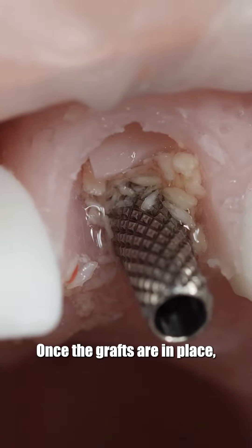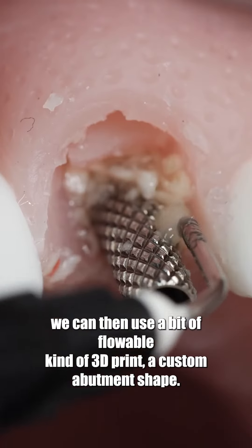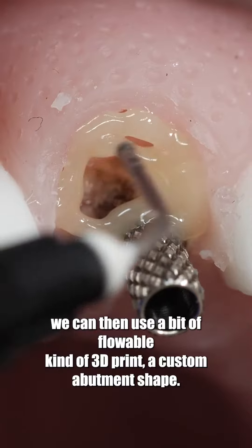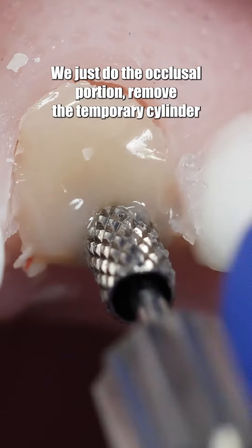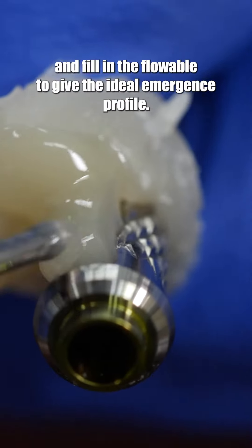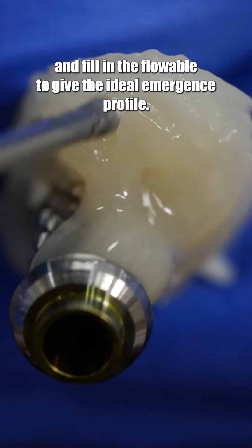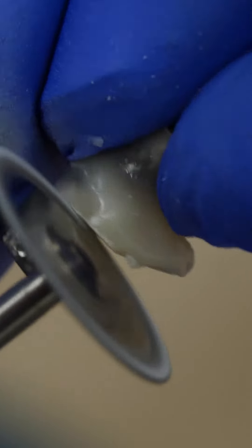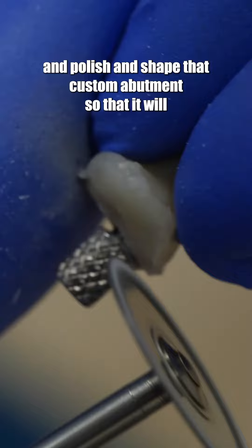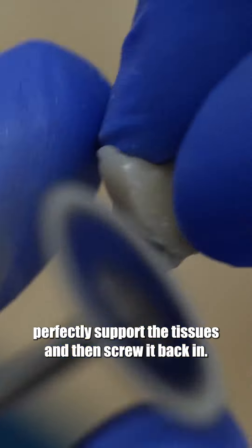Once the grafts are in place, we use a bit of flowable to kind of 3D print a custom abutment shape. We do just the occlusal portion, remove the temporary cylinder, and fill in the flowable to give the ideal emergence profile. Once done, we cut off the cylinder, then polish and shape that custom abutment so it will perfectly support the tissues, and screw it back in.